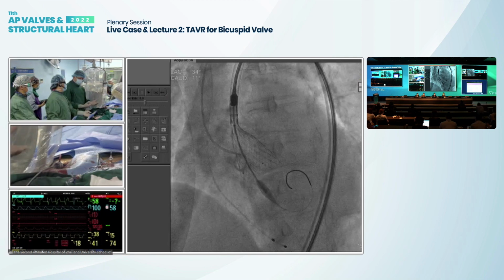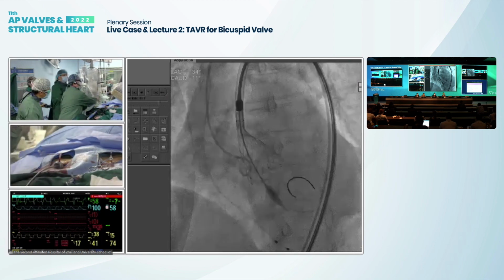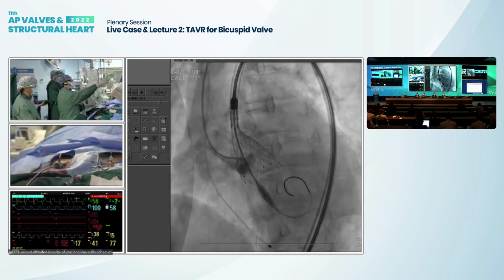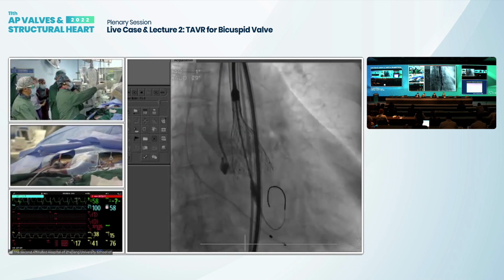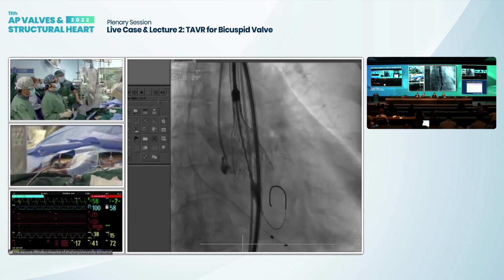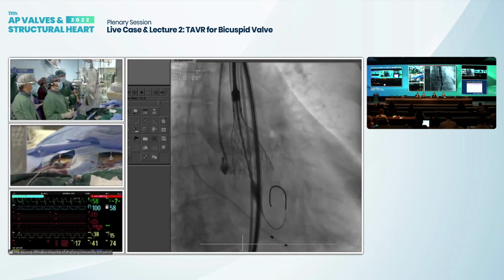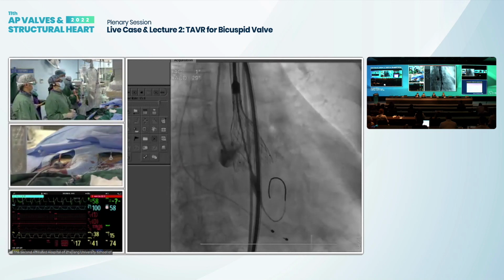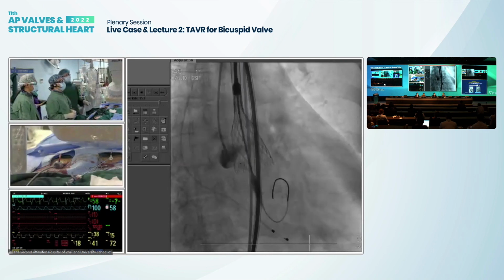So we already retrieved several times. I worry about that. You try releasing it and see how it looks. It will correct itself. It's okay here. So Dr. Liu would like one more retrieving. Yeah, I just worry about it being too low. Is that possible?